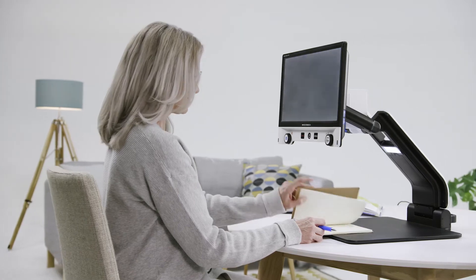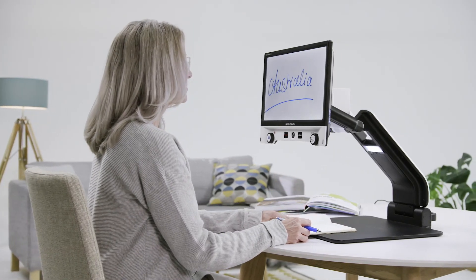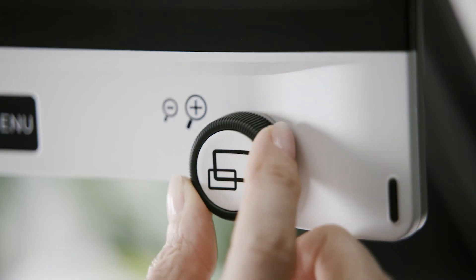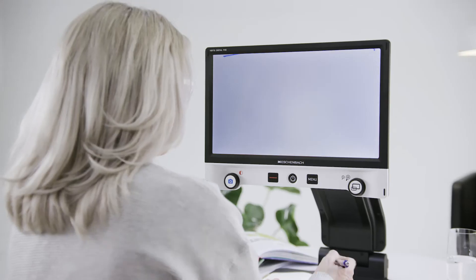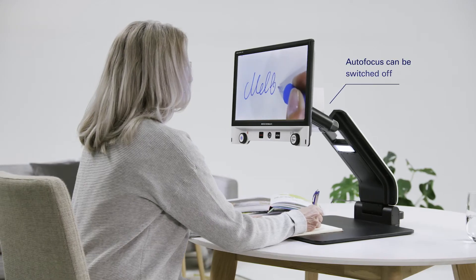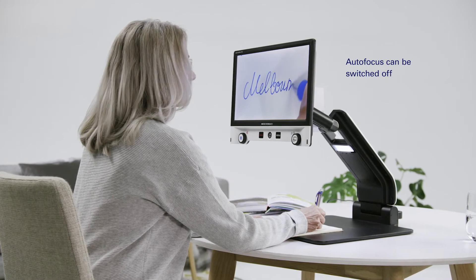The Vario Digital FHD is not only useful for reading, but it is also ideal for writing. Select the suitable magnification level required for writing and simply deactivate the autofocus so the camera stays focused on the page, even if your hand goes under the camera.